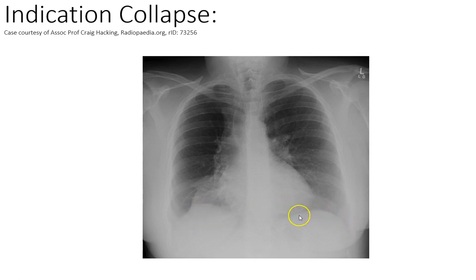Again, still loss of distinction in that angle, and I think that must be a body habitus thing more than anything else. Just the way that it's slightly whiter and whiter and whiter as you go down. That's how it makes me feel when I'm looking at that.